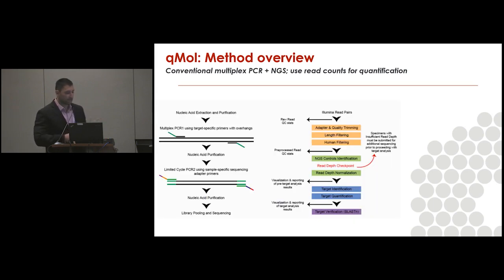analysis. And so basically the overall picture of how that happens is that we take our specimens, they're spiked with a known quantity of that QSM, the same quantified standard material that's in the FilmArray pouch. The specimens are extracted like normal, and then we do a highly multiplexed PCR. This is with targets that are independent of the FilmArray targets. So they're independent PCRs. They are then tagged with DNA barcodes for next-gen sequencing, pooled together, and then put through a next-gen sequencing pipeline. Our biomath team and software team then developed custom software to analyze all this next-generation sequencing, and the end result is that you get a quantitative analysis of these next-gen sequencing reads.